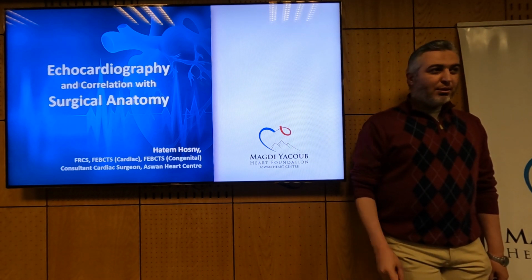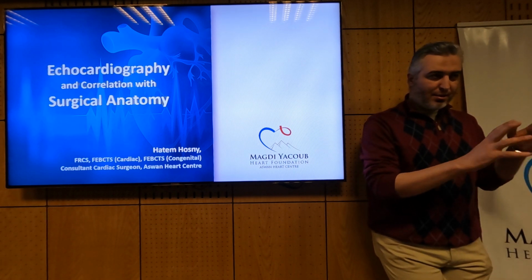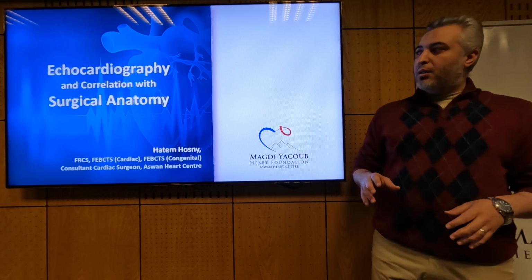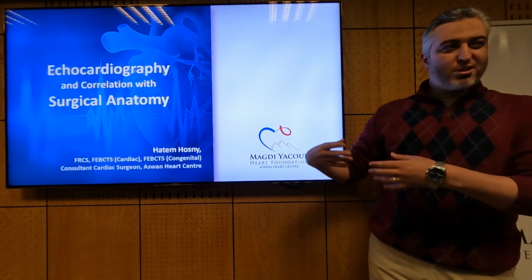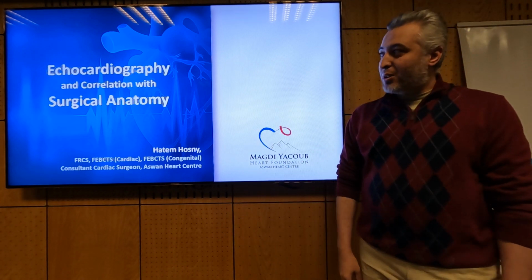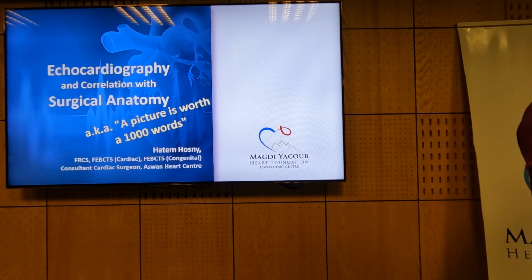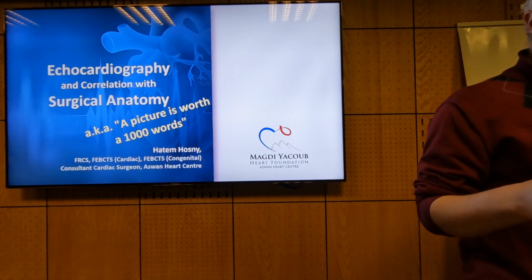We'll be talking about echocardiography, but not to teach you echo. It's to get you familiar, if you know surgical anatomy, and then we will get to know surgical anatomy as we go through. It does make a big difference to actually know anatomy when you're looking at echo views.